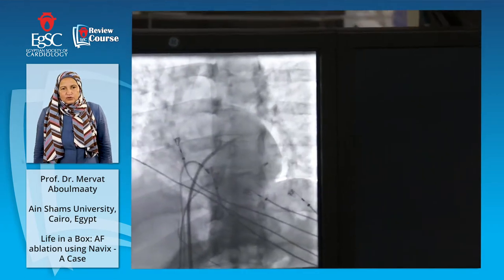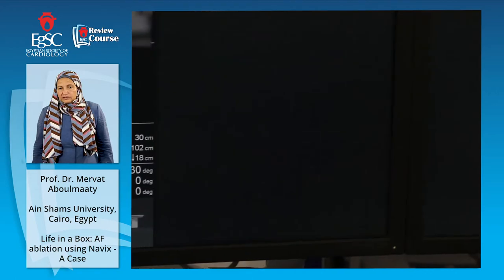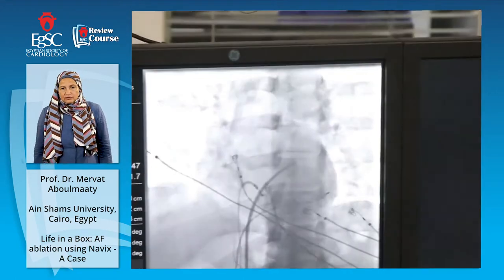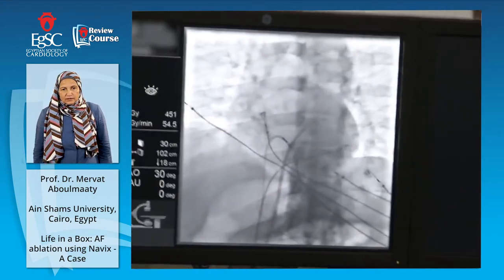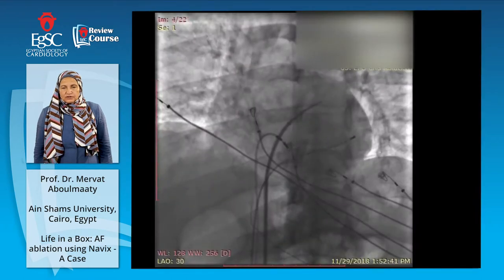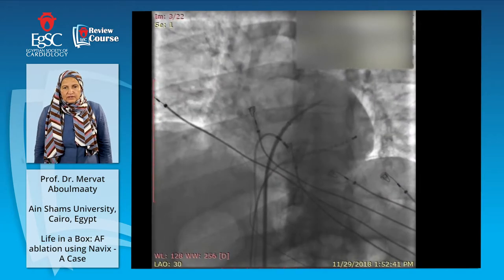The needle is introduced, and we did transeptal puncture. And the sheath is now into the left atrium. As you see, we inject dye, we push the sheath into the left atrium. Here, another view in the left anterior oblique view.